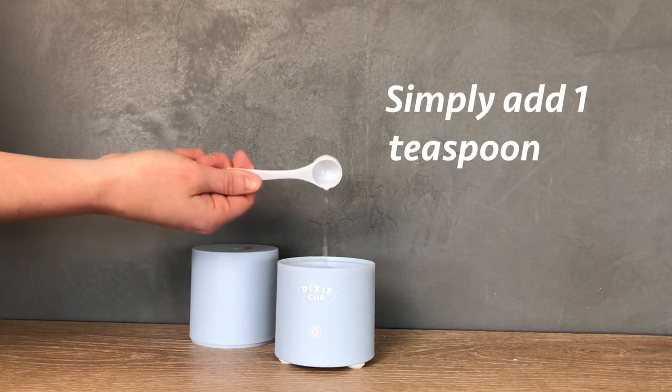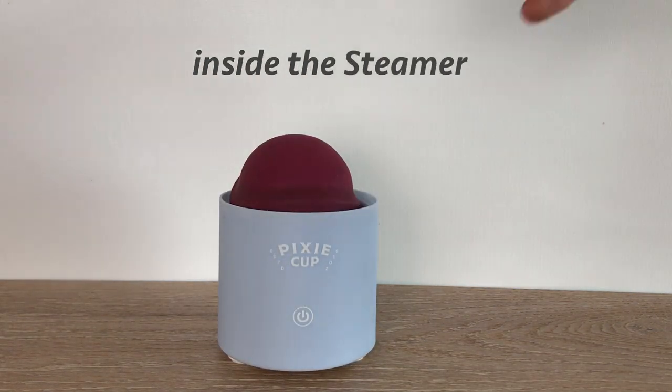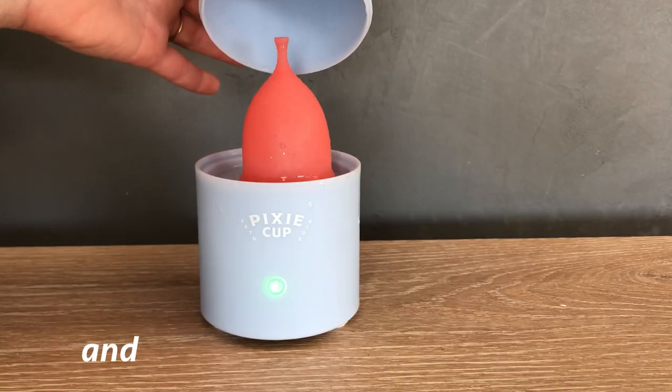Simply add one teaspoon of water, place the cup or disc inside the steamer, press the button, and wait for the magic to happen.